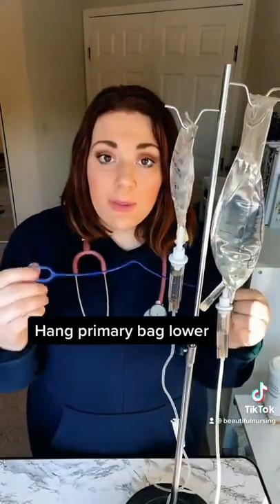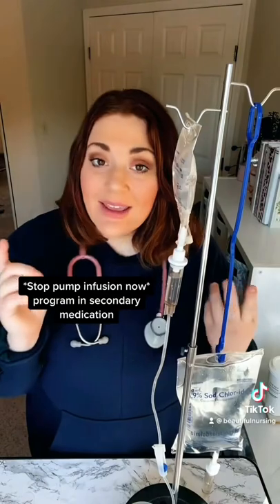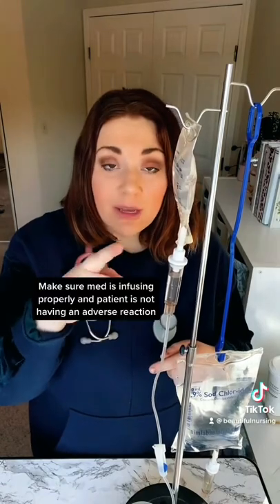We're going to be hanging our primary bag lower. Remember that there are no bubbles in the line and everything is at the appropriate height. You're now going to stop the infusion pump, program your secondary medication in, unclamp all your tubing, run the line, and stay with the patient. Make sure that everything is correct before leaving.